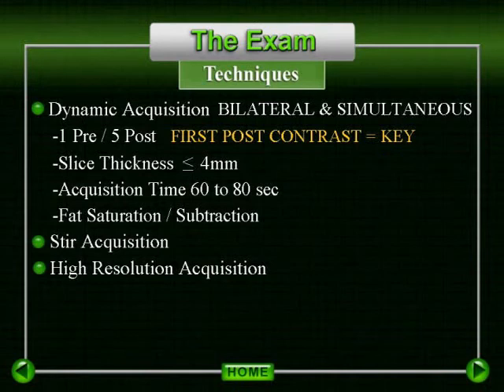We have additionally found the STIR sequence to be of use in evaluating areas of non-mass-like enhancement, particularly when trying to differentiate fibrocystic change from in situ carcinoma. You will see examples of this in the teaching file section of this training tool. The final imaging sequences are utilized primarily for high-resolution evaluation of the parenchyma.